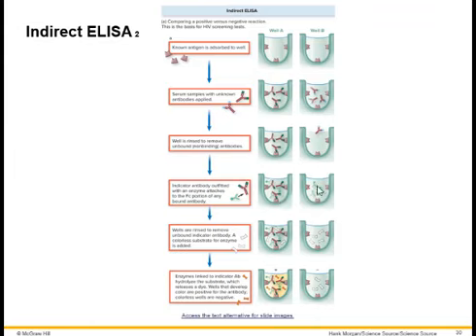So there are no antibodies in well B for the secondary antibody with the enzyme attached to stick to, just antigen. And so when you do the rinse, those antibodies wash away, and when you put the colorless substrate in, it turns to a colored product in well A. In well B, where there are no antibodies and no enzyme left, when you put the substrate in there, there is no reaction. So the color change indicates a reaction, and no color change means you do not have the antibodies in the blood.